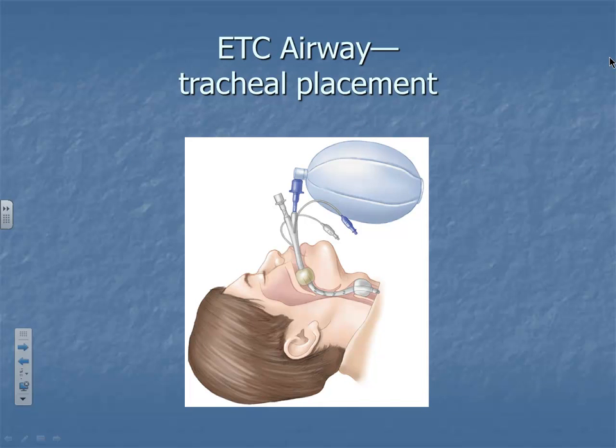What do we got here? Oh, yeah. The ETC, that's going to be the Combitube. The esophageal tracheal Combitube.